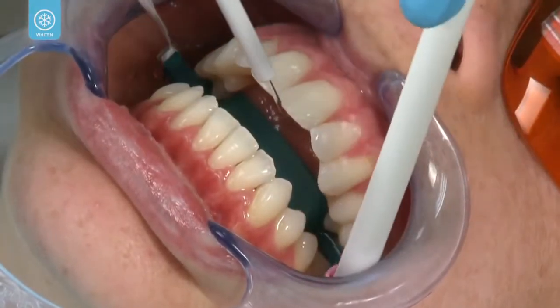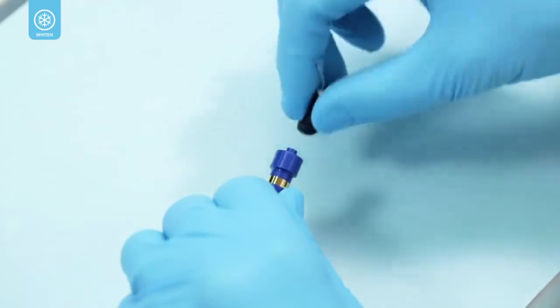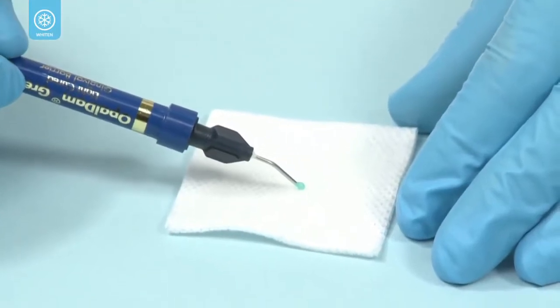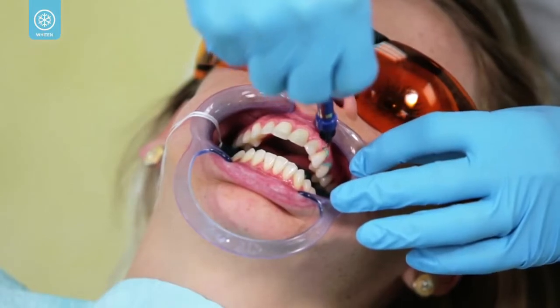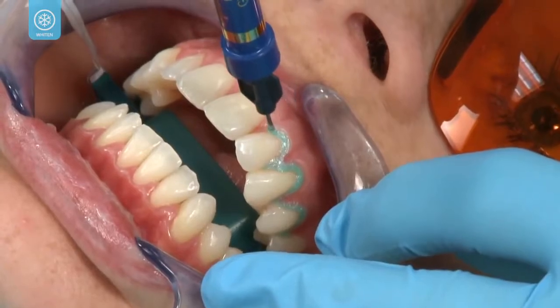Now you're ready to place the resin barrier. Start by removing the luer lock cap from the Opaldam green syringe and securely attach a micro 20 gauge tip. Verify flow prior to placing intraorally. Then express a continuous bead of Opaldam green along the gingival margin, overlapping approximately 0.5 millimeters onto the enamel.